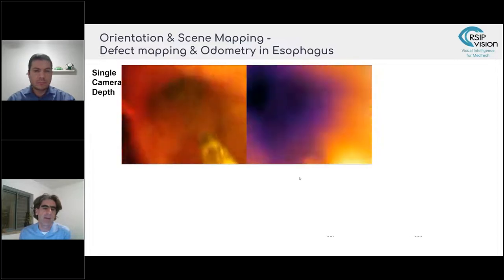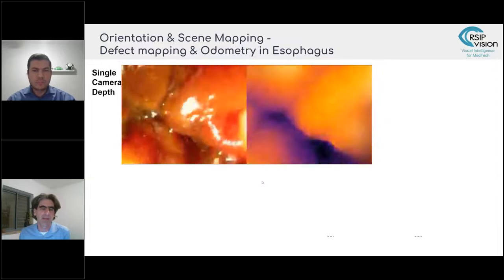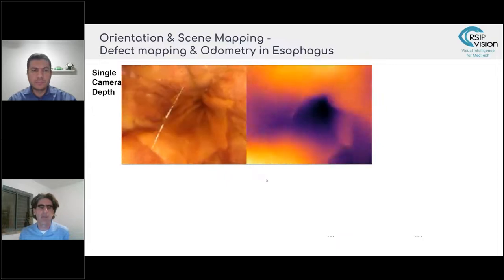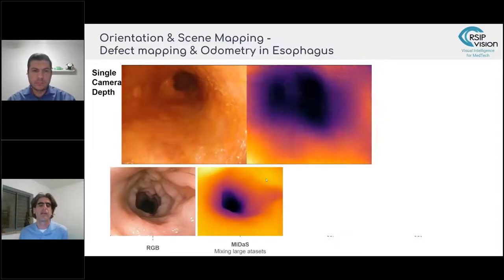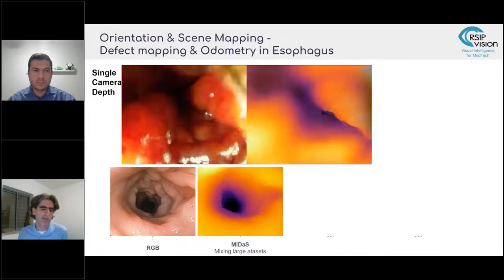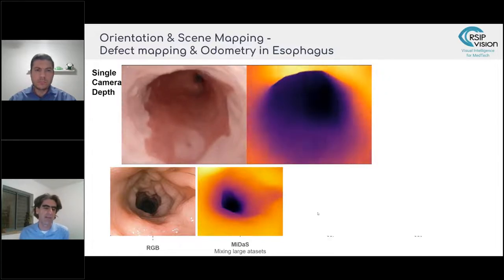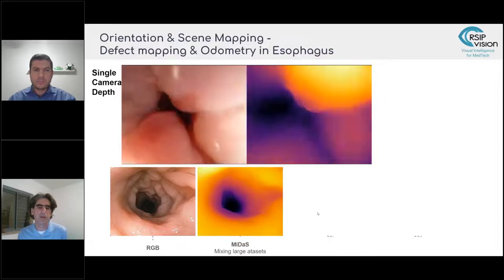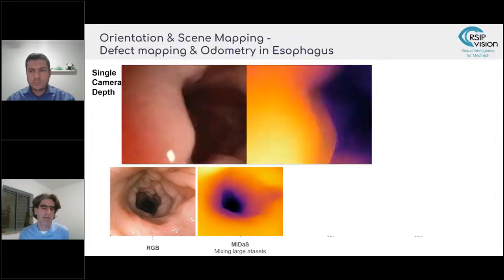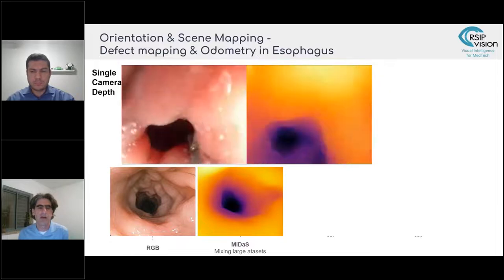Now, how do we do this? It's very difficult to obtain a ground truth for this type of problem. We're not putting a 3D camera or a time-of-flight camera into the esophagus or anything like this. But there are solutions that enable us to leverage data from other domains and to train a model. So the first solution that came out a couple of years ago in the literature was called MiDaS, mixing large data sets. And what these guys did is they took automotive data sets, they took depth camera data sets containing ground truth from a number of domains, and they showed that this can be generalized by some clever tricks of normalization of the input and proper training.